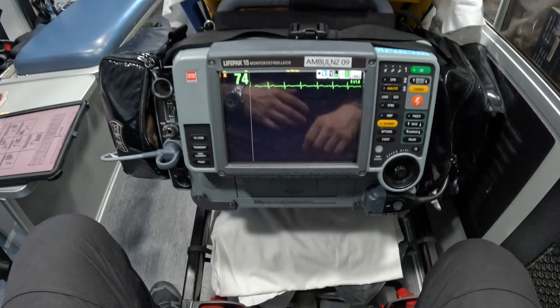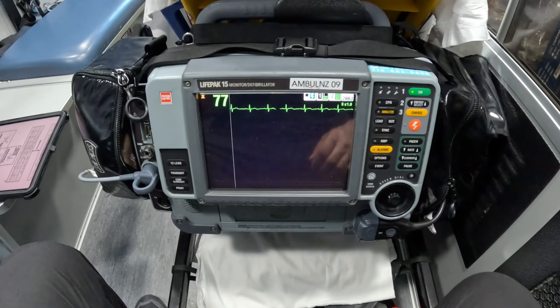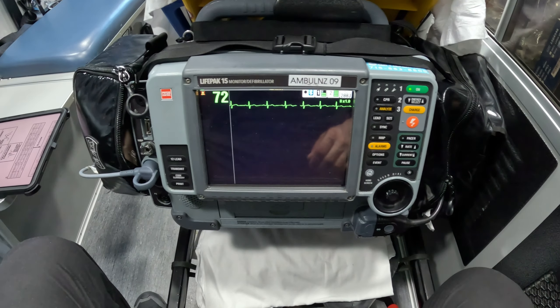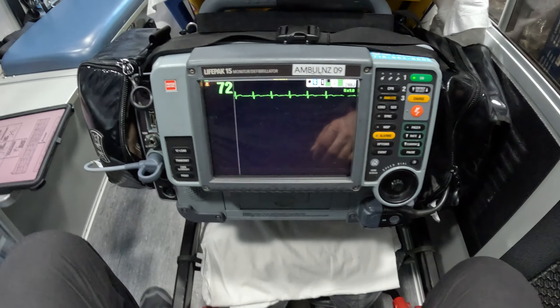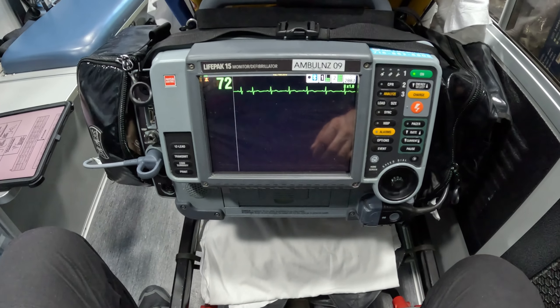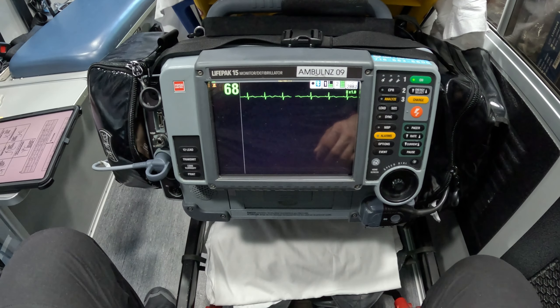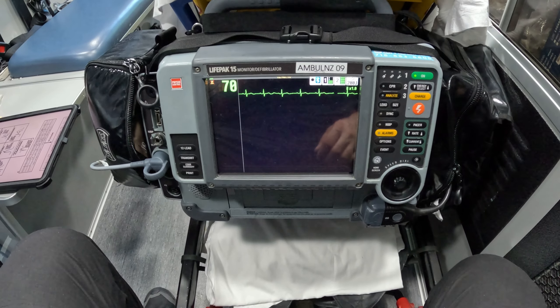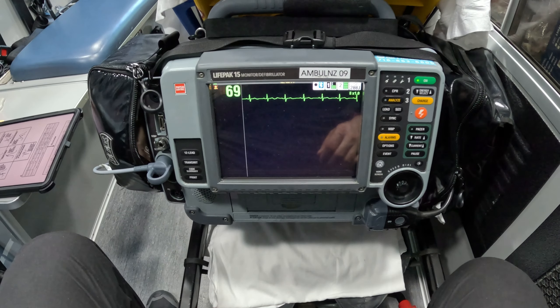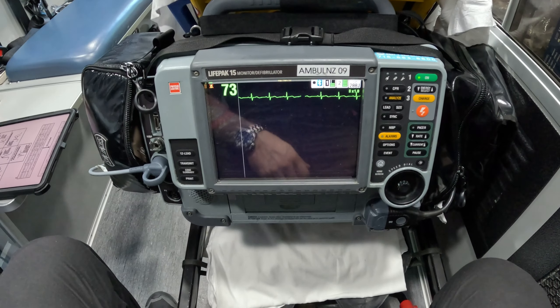Hello guys, my name is Nikolai Yusupov. In this video I'd like to show you how to perform ST segment deviation training. So for you to perform the ST segment deviation training on this monitor, you first need to perform a standard 12-lead EKG.